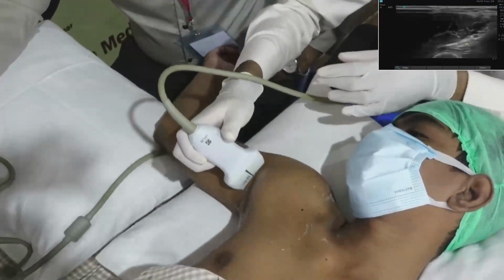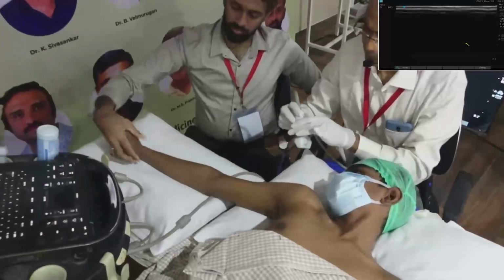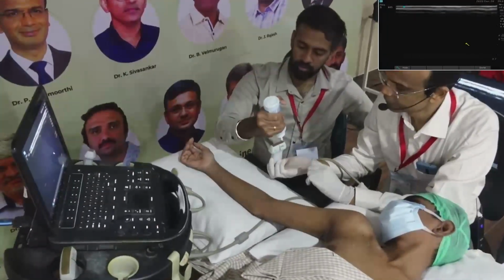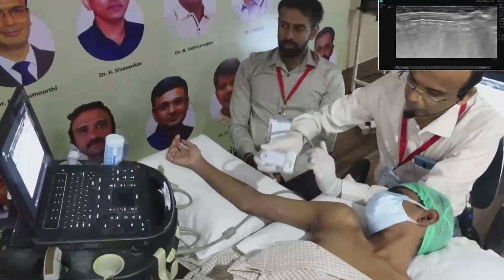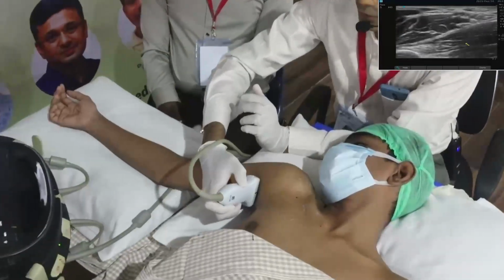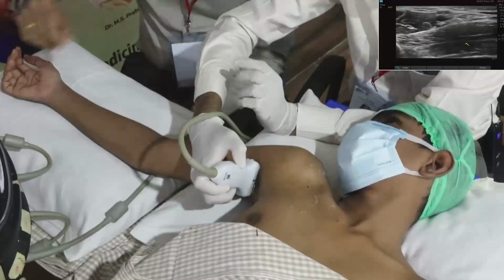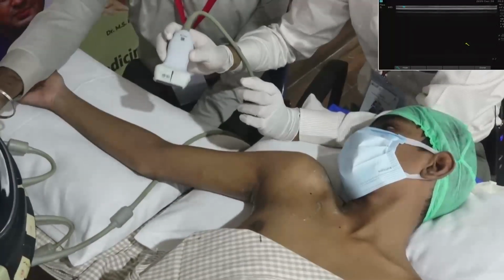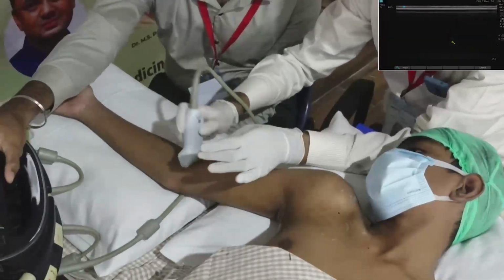Okay, now I will move on to median nerve scanning. For median nerve scanning, again we can trace it from the axillary area. Sometimes we find it difficult to trace where the median nerve is. So to make identification very easy, you have to start from the elbow.